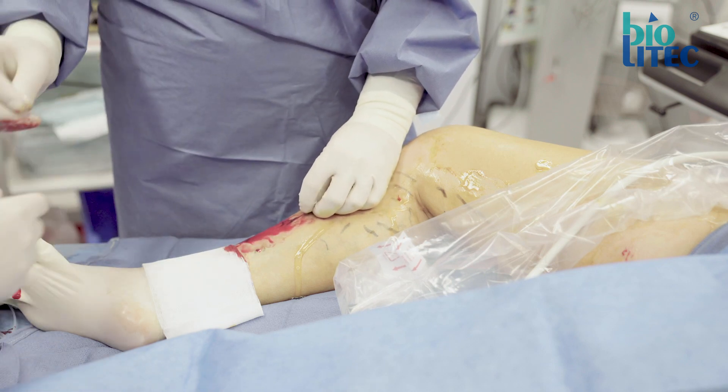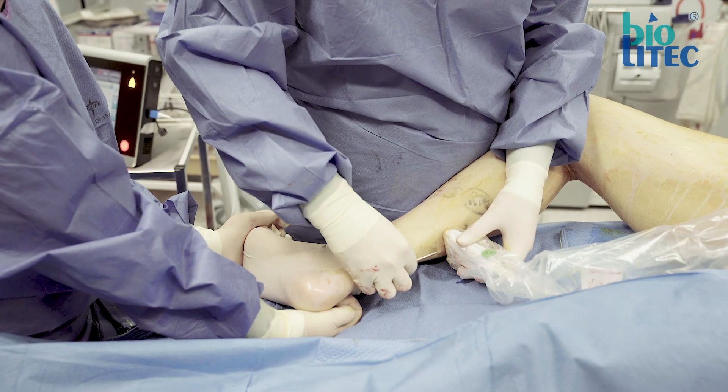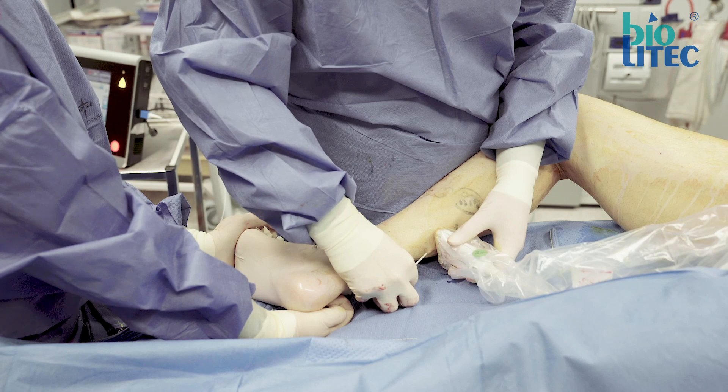If you don't succeed, consider other places or ways to access the vein and try again. Wait at least two minutes before trying a different place in the same leg to avoid spasm and a blurred view.